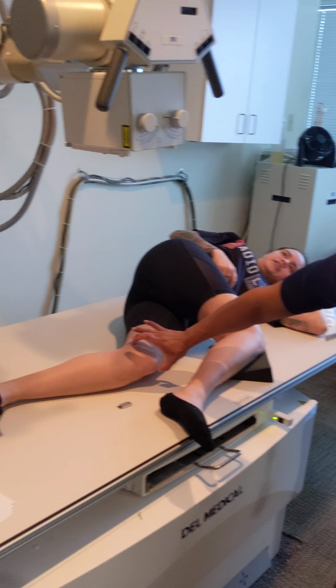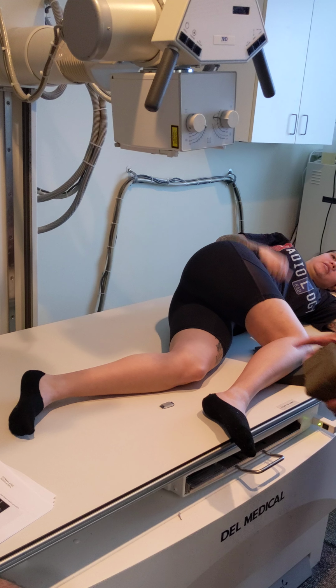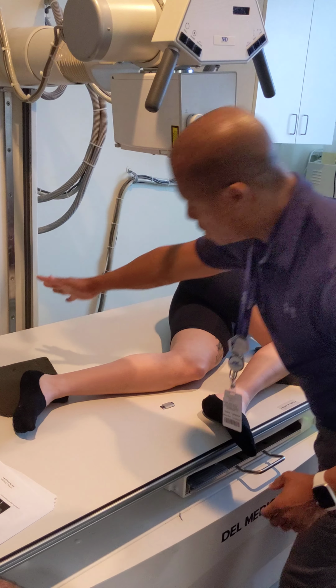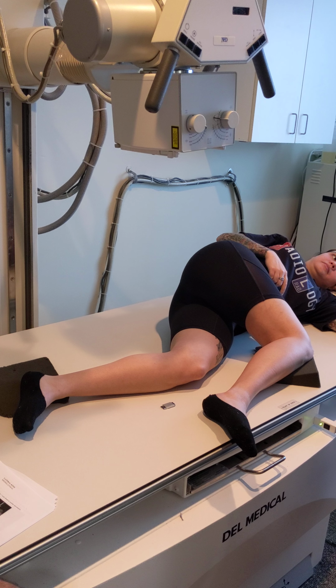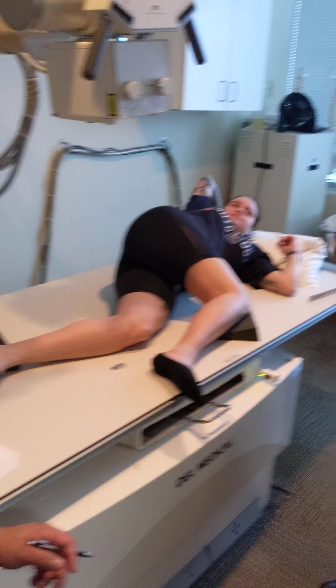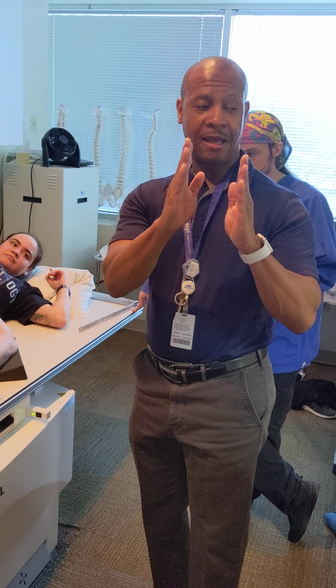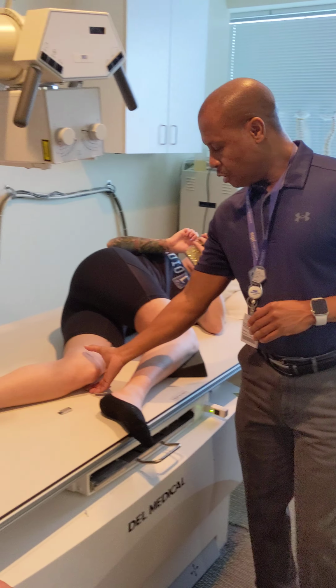Like my heel's down now, that rolls it out, so it rolls it that way. But with my heel up, then it rotates it back. Okay. So do you want us to rotate it forward like that, or is that too much? It needs to be straight, and it's going to be, like, every patient's different kind of thing?